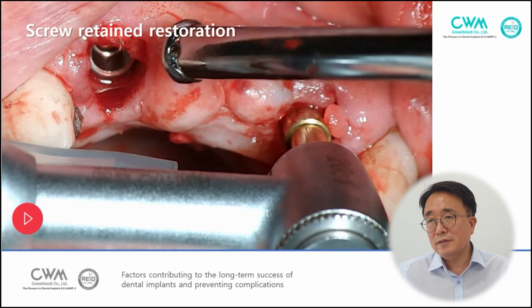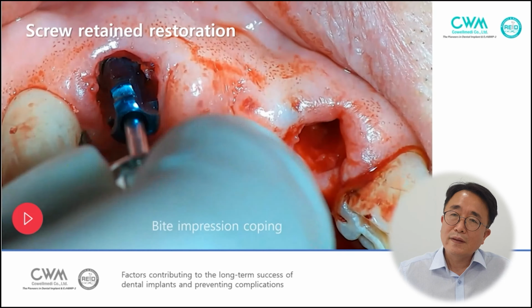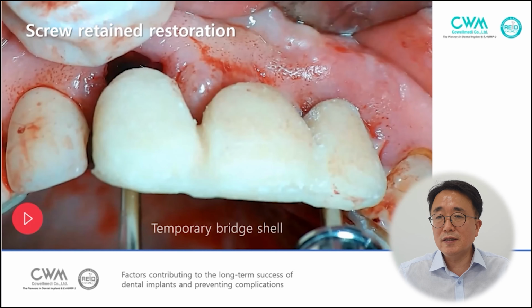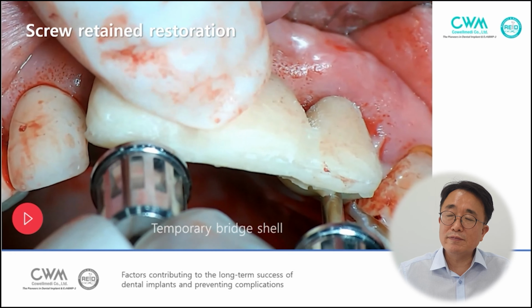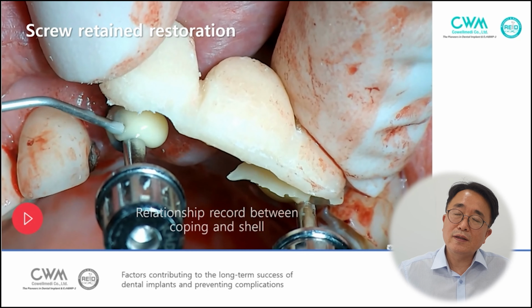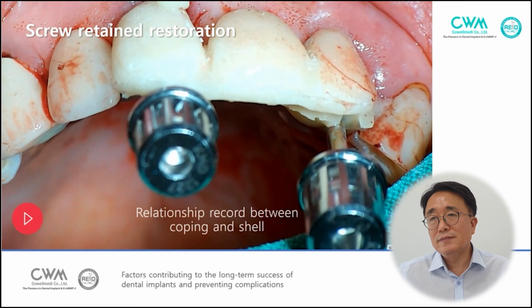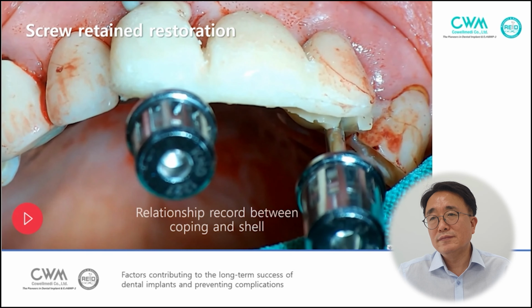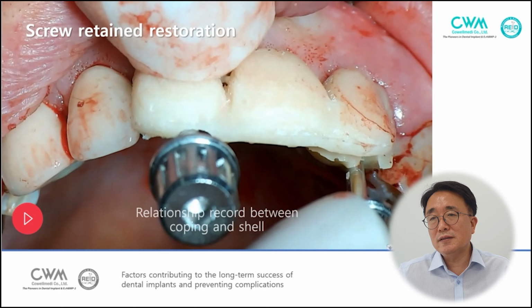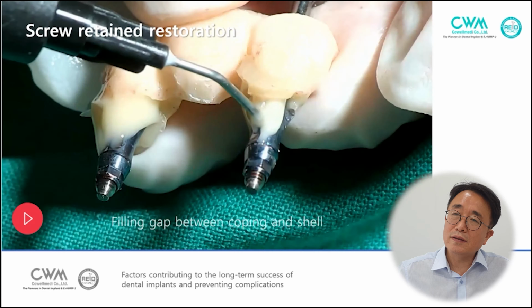The driver has a depth guideline, and then the impression coping. The bite impression coping is connected, and the temporary bridge shell is connected with the bite impression coping with light curing resin, and then this connection is connected with the two components.